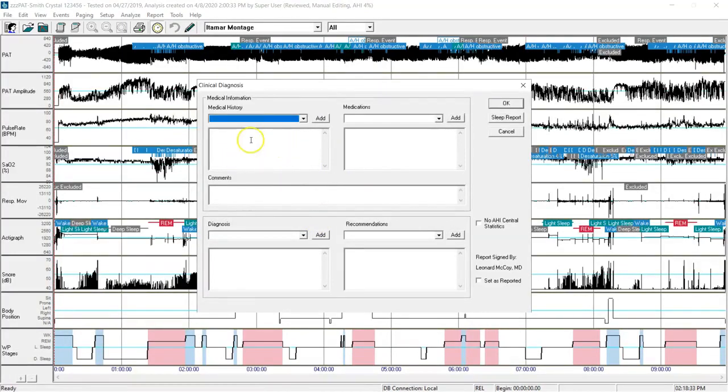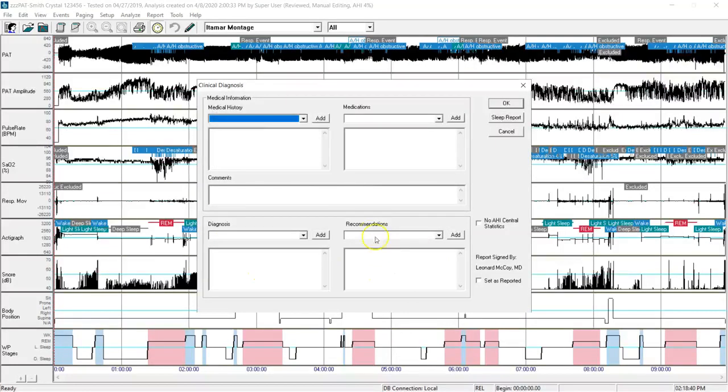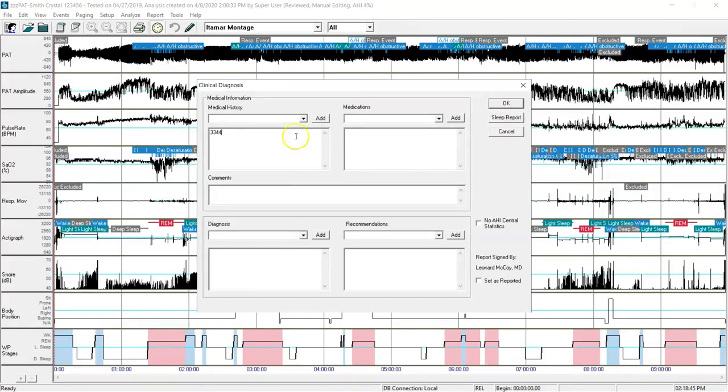This will open up a blank slate for me to put in additional information into my diagnosis and recommendations. I can put additional history items, medications, comments, and of course when I get down to the diagnosis and recommendations, there are built-in templates for these, and you can free type in the fields as well.